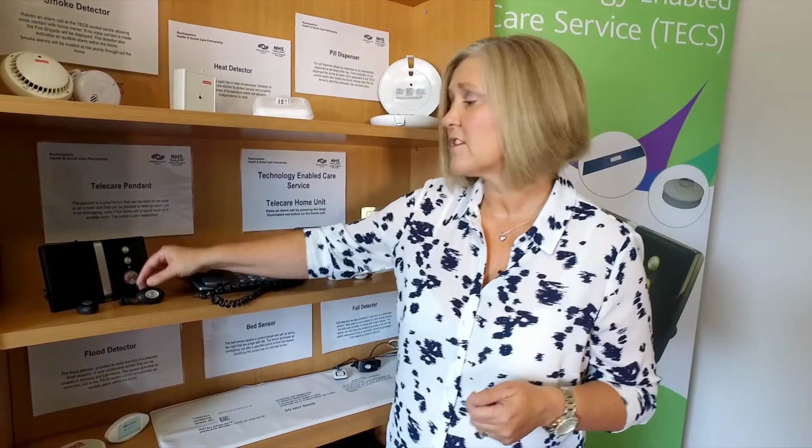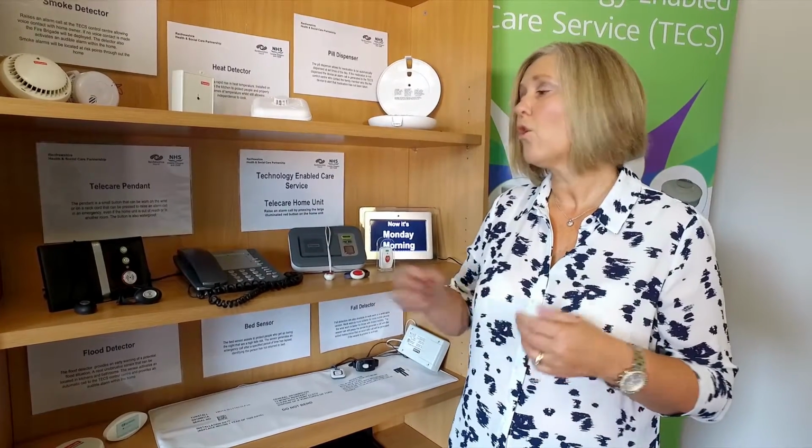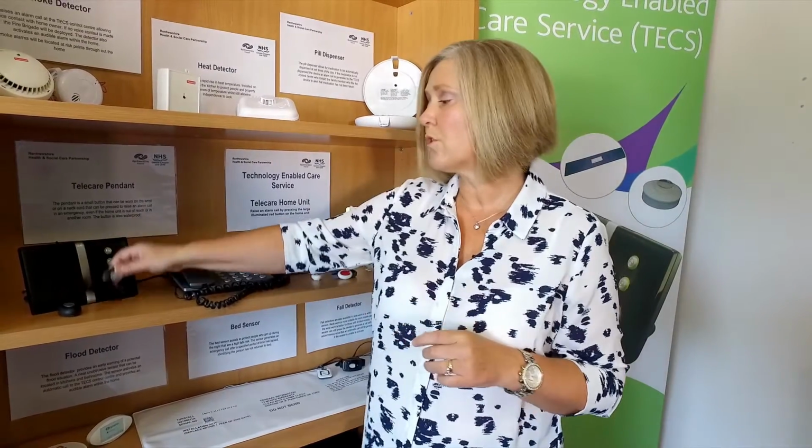So the other thing is, whenever you go for a shower during the day, if your carers are coming in, or if you're doing your dishes, just push the pendant up your wrist if you're wearing it on a wristband, and don't worry about getting it wet because all the pendants are fully waterproof. They come with the sort of material that if it did get wet, it can be simply dried by having a towel brushed over it. So always wear your pendant.